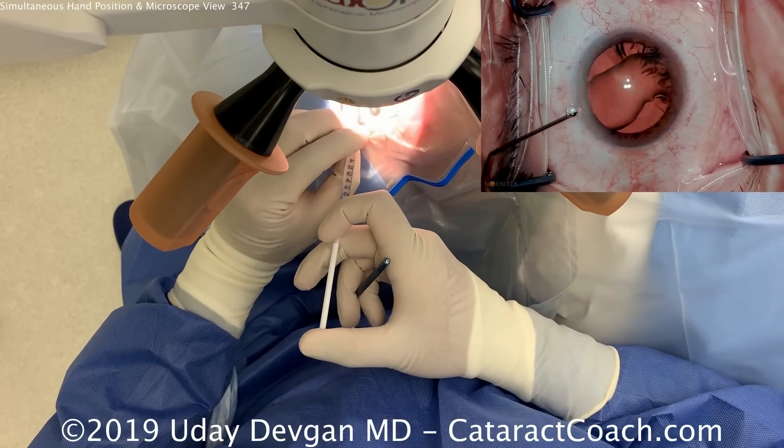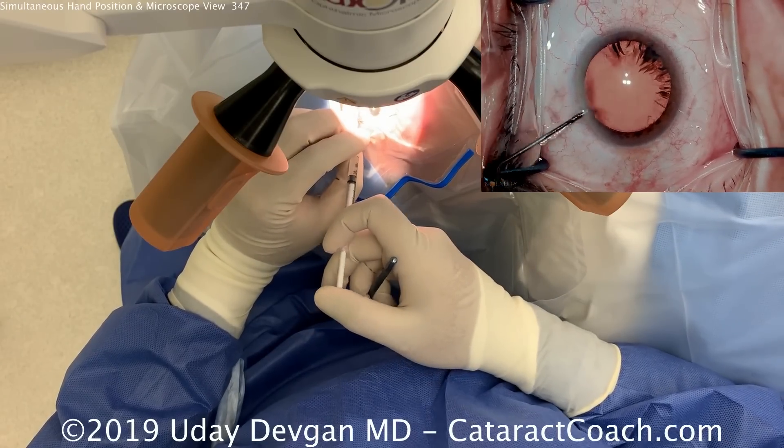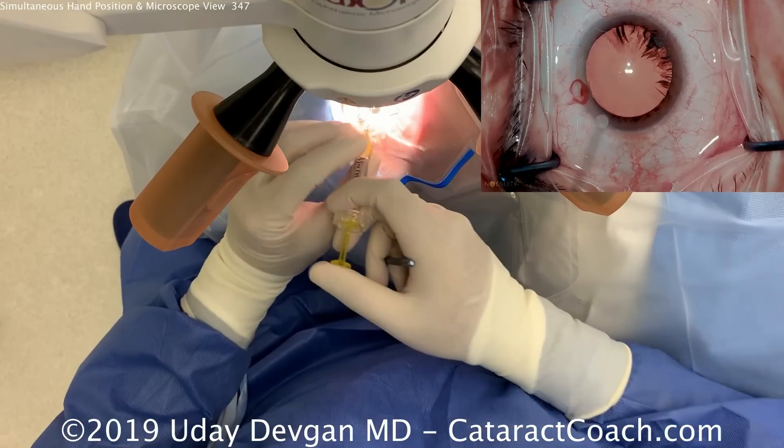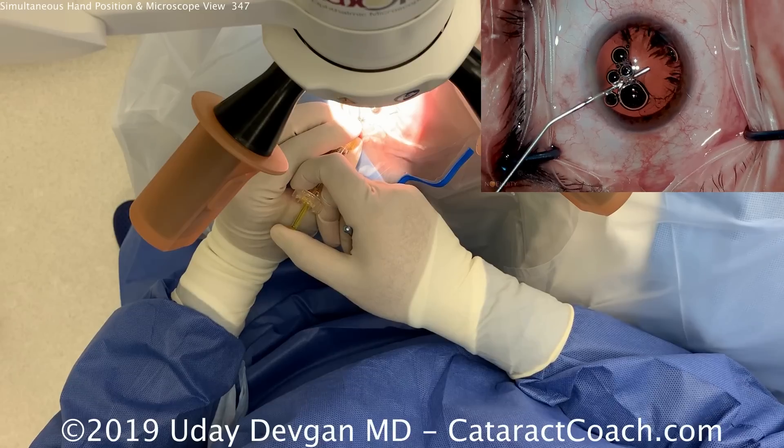Now we're going to fill the eye with some anesthetic. This is a preservative-free lidocaine solution mixed with balanced salt solution. An important thing here — look how we're holding it. The left hand is holding the viscoelastic cannula like a pencil.